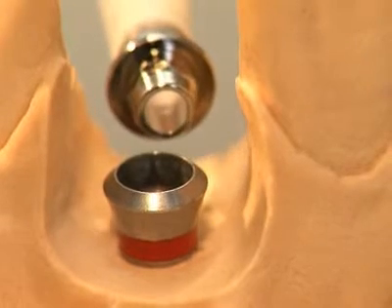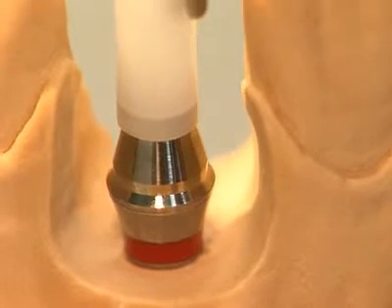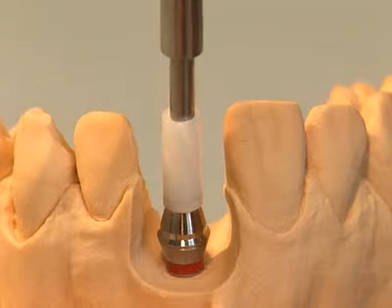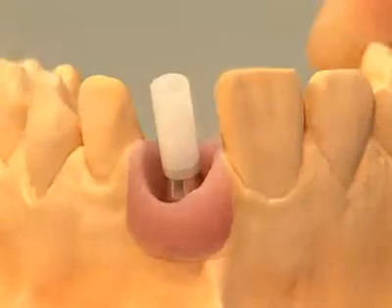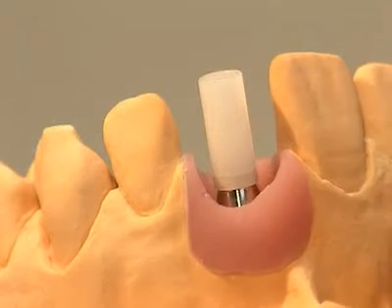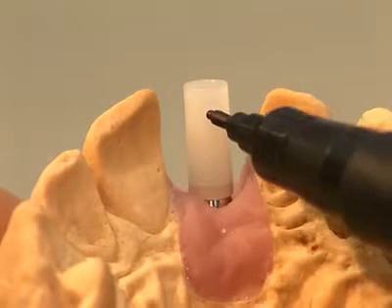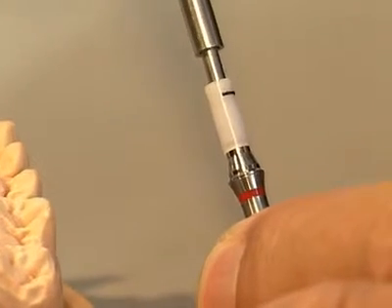The regular neck Synocta gold abutment is placed on the analog and aligned with the internal octagon. The needed height of the plastic modelling aid, according to the height of the occlusal plane, is marked on the plastic. For easier handling of the abutment, the use of an additional analog is recommended for manipulation outside the model.